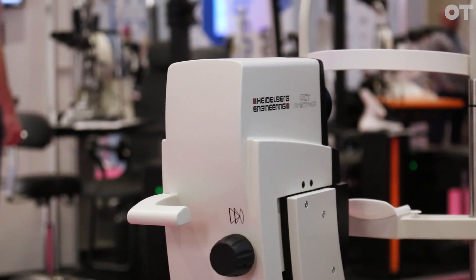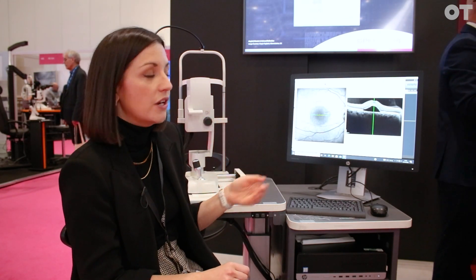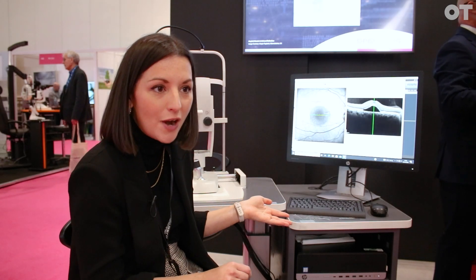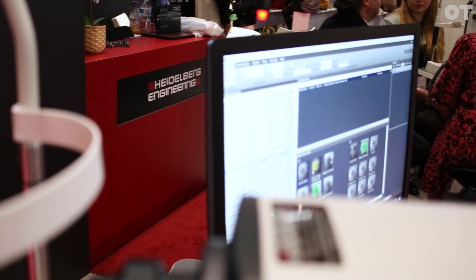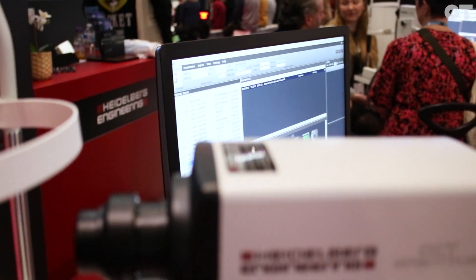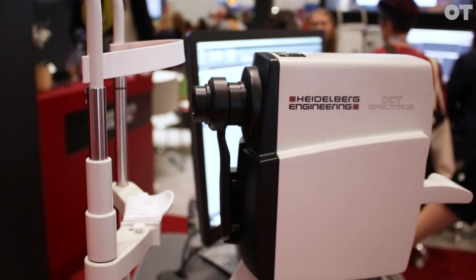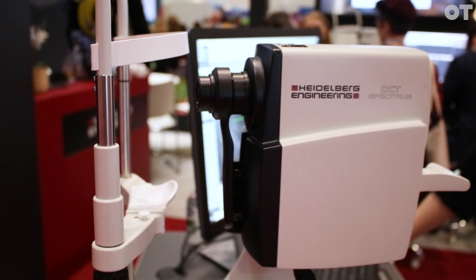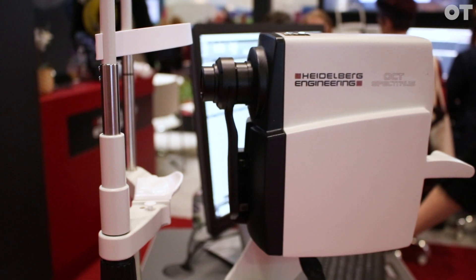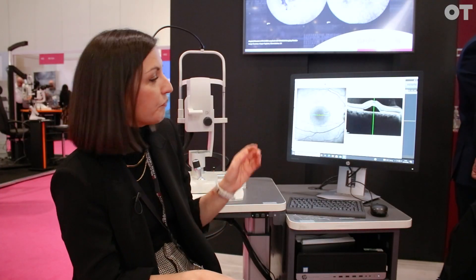Some of the unique technologies it employs are the confocal scanning laser — this lovely infrared image. We can image straight through media opacities and undilated pupils, so even in bright light like this room we're able to image. That's really nice in a high-street optometry practice where you don't necessarily have to dilate the patient. And of course it also does simultaneous OCT imaging — at the same time we take this confocal scanning laser image, we also take this really nice OCT image.